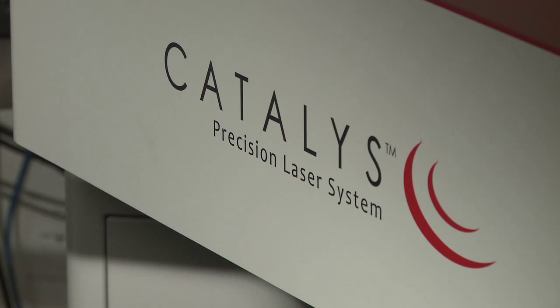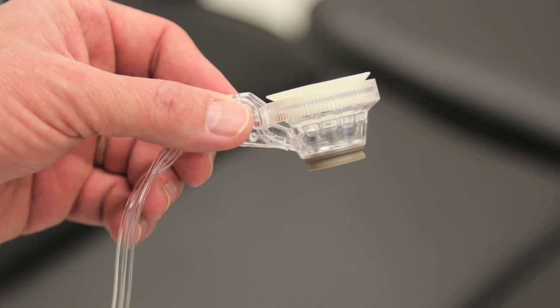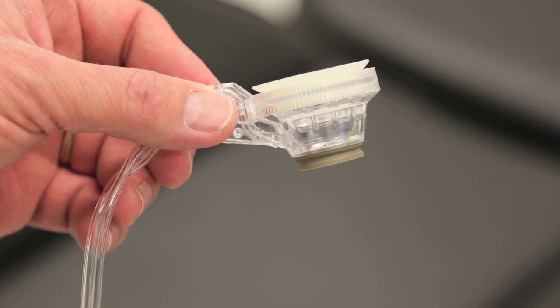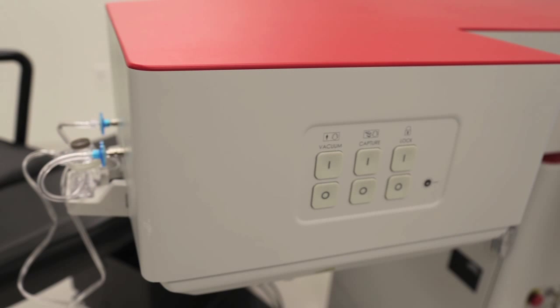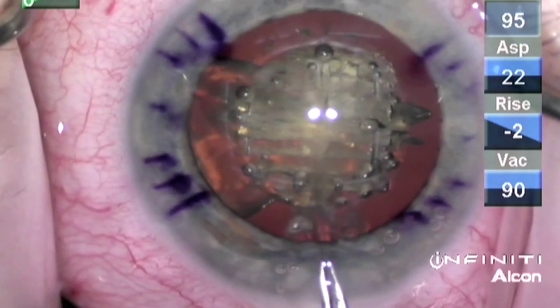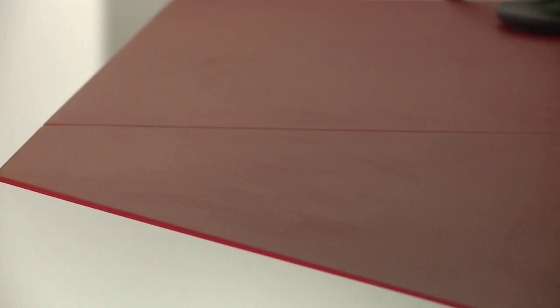This is actually the second laser system we acquired, the OptiMedica Catalys. Rather than applanate the cornea, a liquid optic interface is used to couple the laser to the patient's eye, leaving the cornea untouched and therefore undistorted. We've observed complete circular free-floating capsulotomies are the norm with this system. The ease of lifting these capsulotomies in contrast to the postage stamp is similar to the ease of simply lifting a napkin off a table, hence the term napkin capsulotomy.